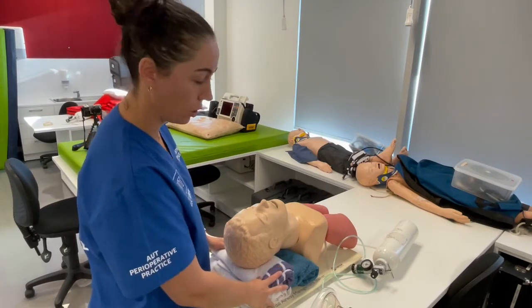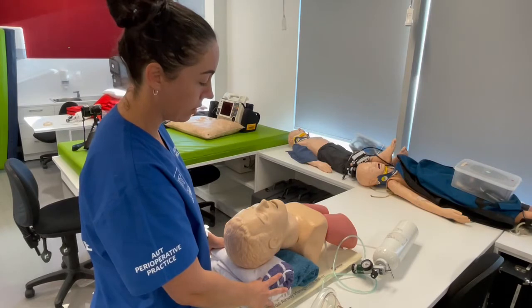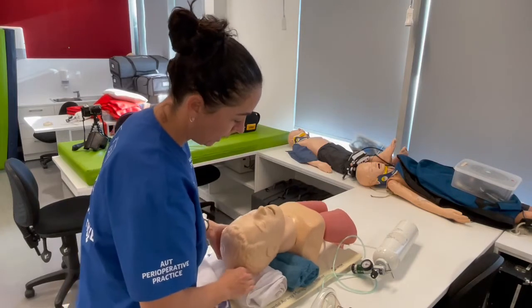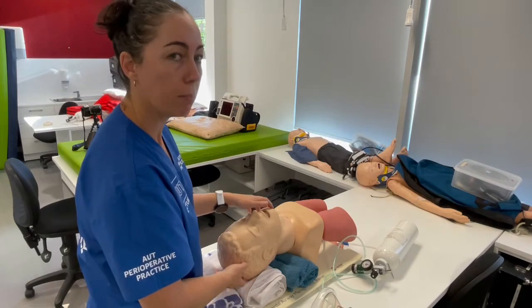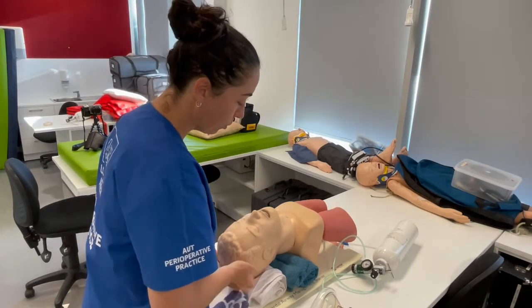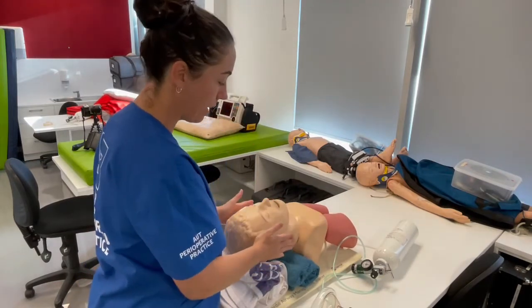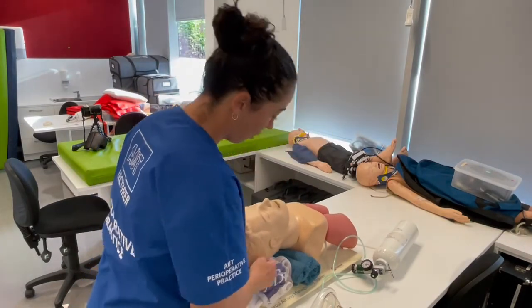Remember it's slightly different for obese patients and pediatrics. For a small pediatric patient, use a shoulder roll and just one towel, keeping the head in neutral position — head extension may occlude the trachea. For obese patients, you'll need extra ramping and padding to raise the shoulders and get the ear in line with the sternal notch.